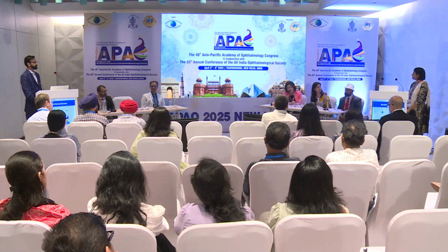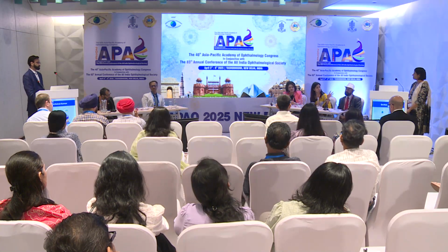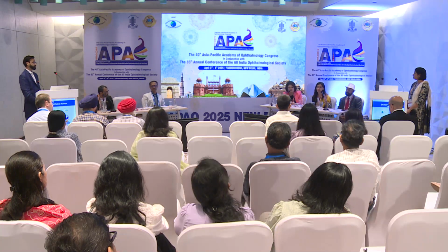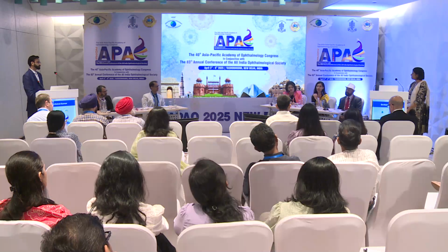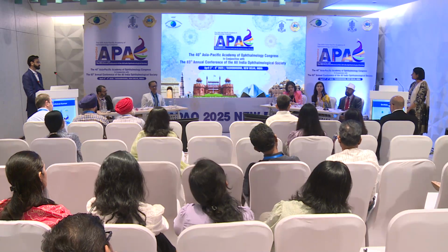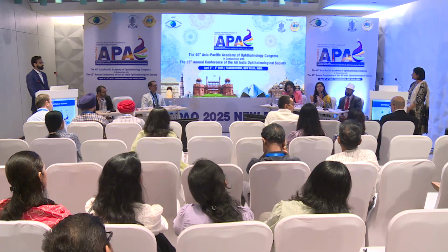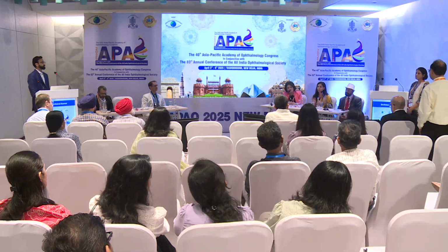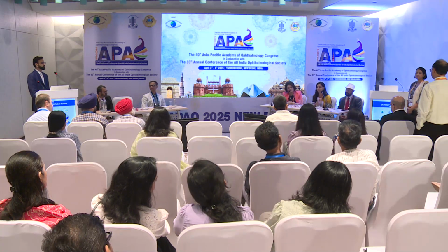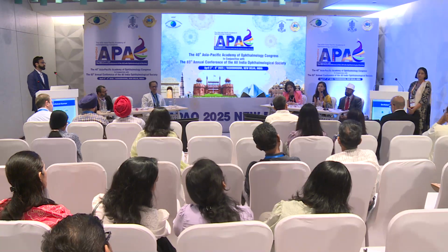Another thing is, it's great, I am a big proponent of using contact lenses of all kinds, and what you showed were predominantly scleral lenses and RGPs. But believe me, it is not that easy for an elderly person to suddenly start using a contact lens. It takes a lot of dexterity, especially the scleral lenses, which have to be put in with a plunger and liquid. Someone who has never used contact lenses all their life will not suddenly get used to putting in a contact lens after a cataract surgery. So you have to keep that as a consideration as well.